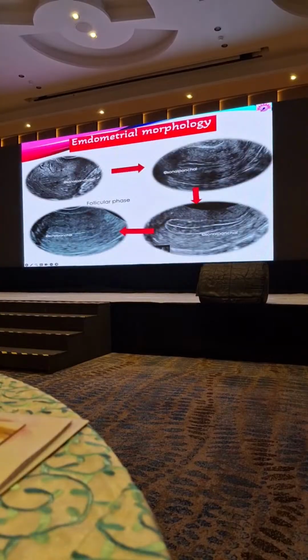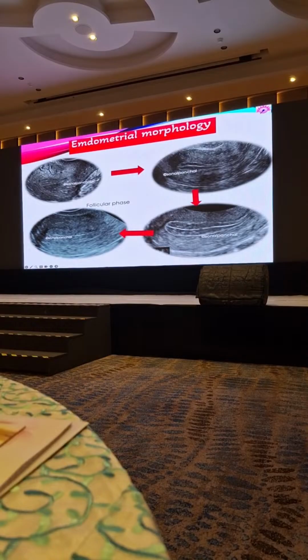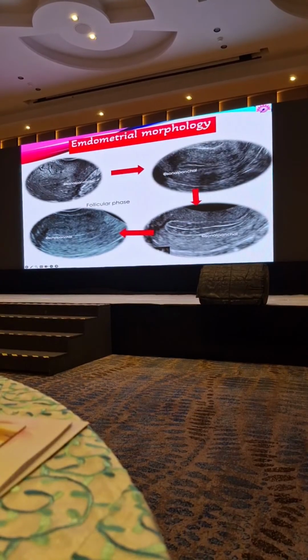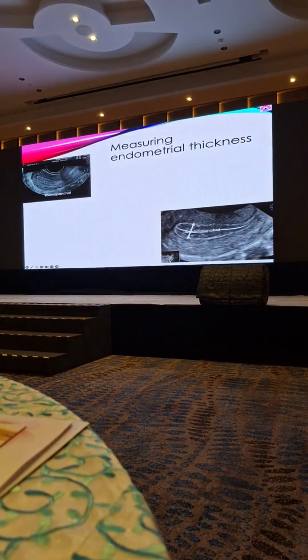Yes, any of these three different morphological patterns is excellent for implantation, and we are going to come to morphology in a minute. So thickness doesn't tell you anything. It has to be a combination of thickness and the morphology which will tell you.